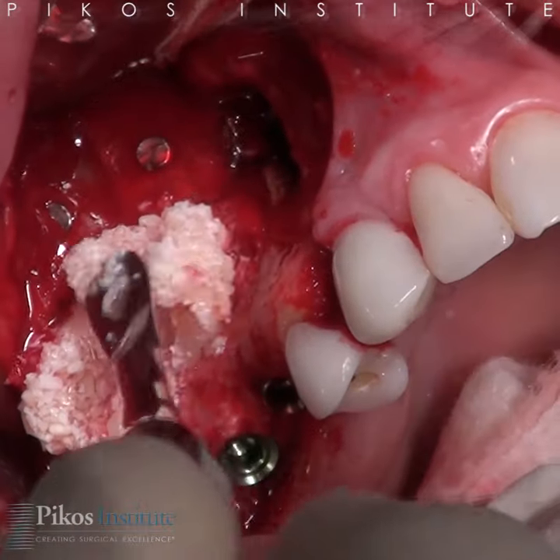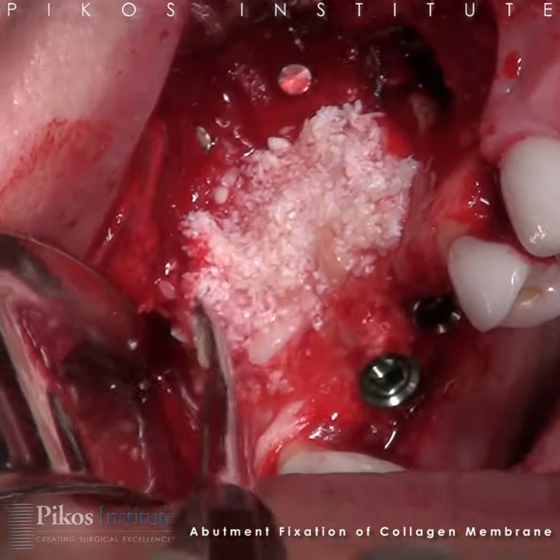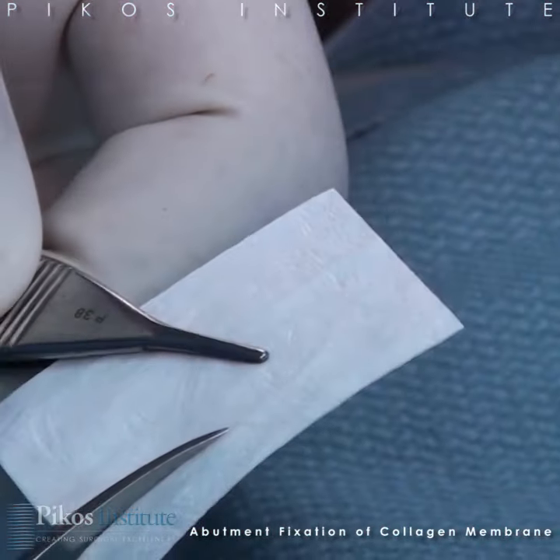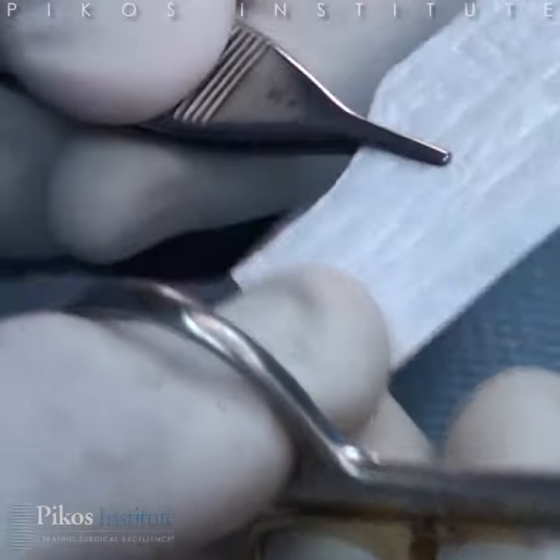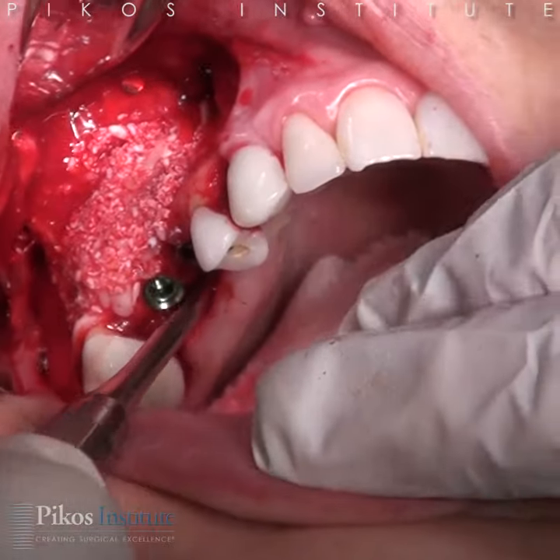We're going to overpack with our graft material in an attempt to get some ridge thickness. We're going to cover this with a 30 by 40 millimeter Memlock membrane, and we'll fixate it with the implants and using our healing abutments.